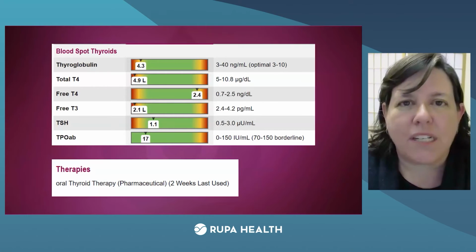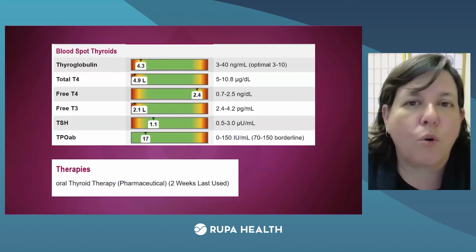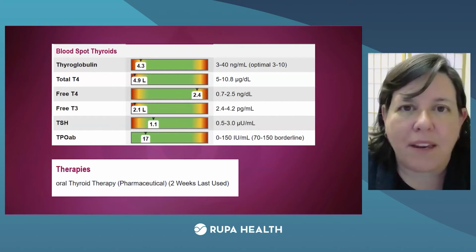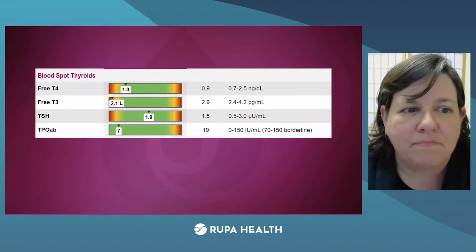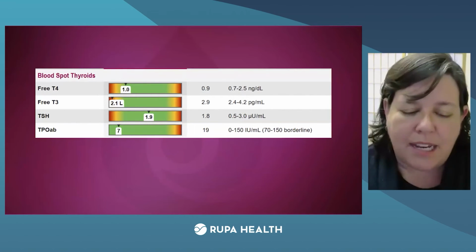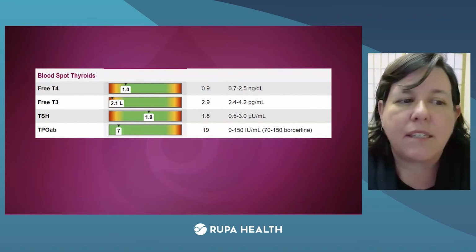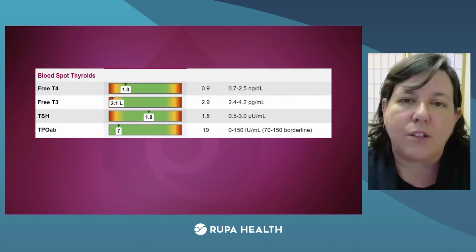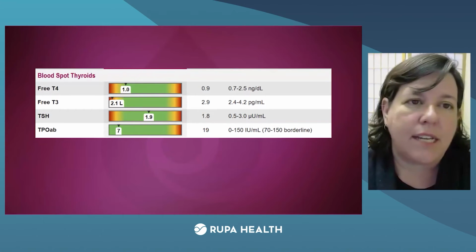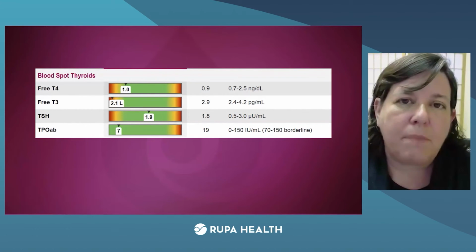You have to give it 4 to 6 weeks for letting thyroid normalize and work through all of its total values and it's bound up and everything. So that's a fun one. I only have a few others, and then I want to make sure I get through everyone's questions. But this is another question, right, of looking at those T4s, those lower T3s, and those higher TSHs. So you'll see this pattern a lot.